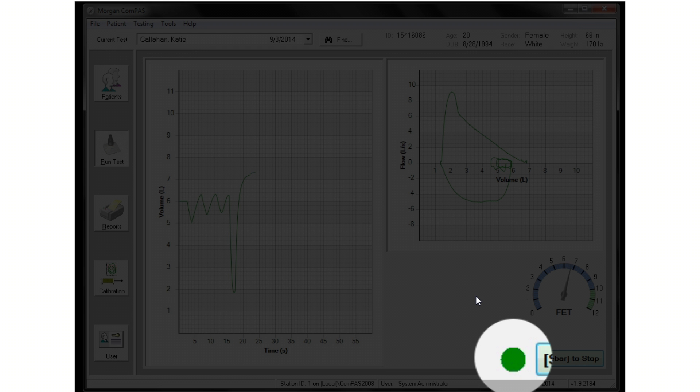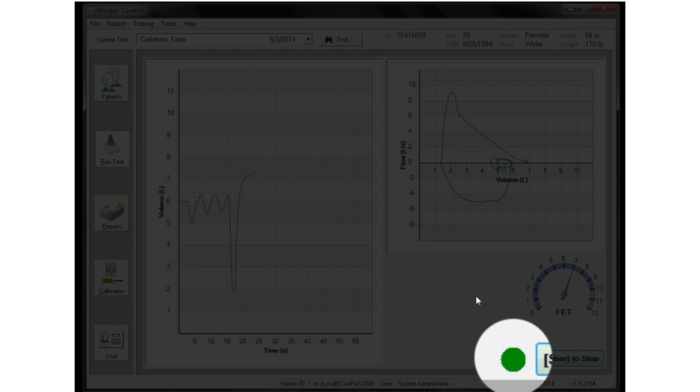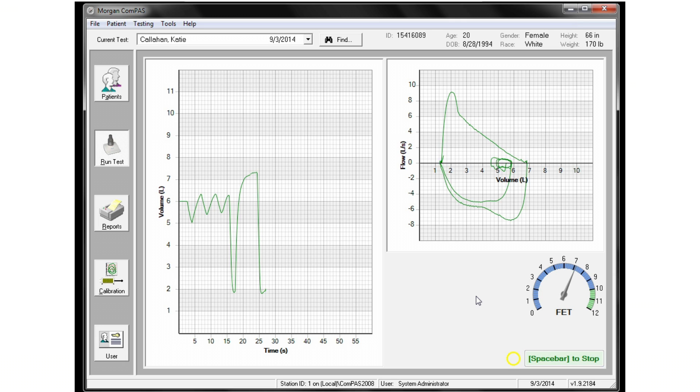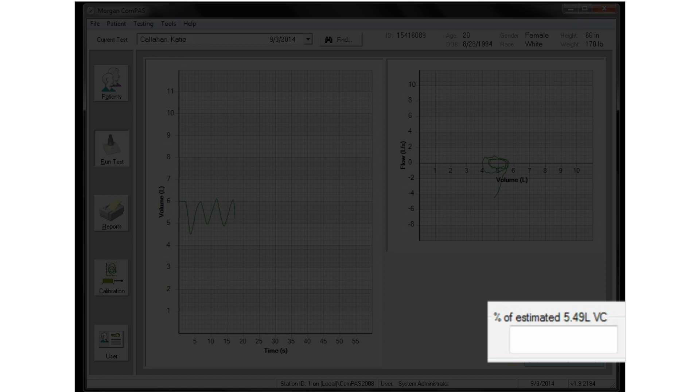The end-of-test detector will turn green when the volume change has ceased, at which point the subject can be instructed to breathe in. On subsequent efforts, a percent of best FVC meter is also displayed.